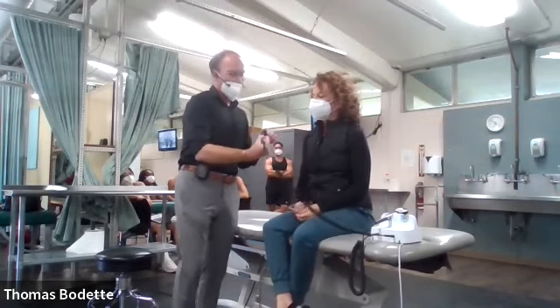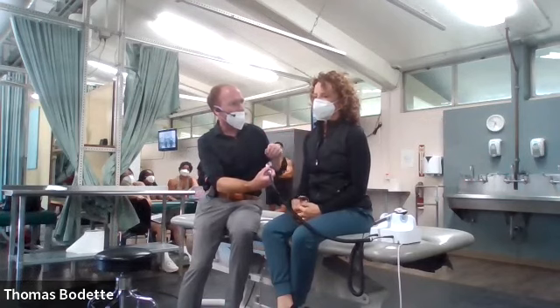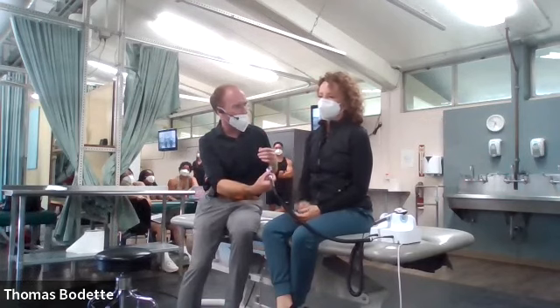You okay with this? Right. Christine, I'm Dr. Bodette. I'm going to be looking inside your ears. So just relax and breathe normal. Try and keep your head still.